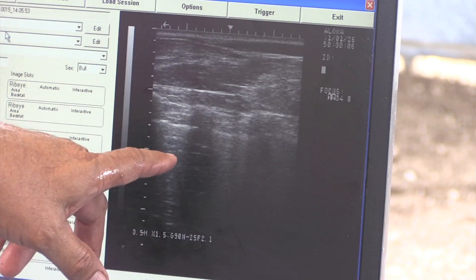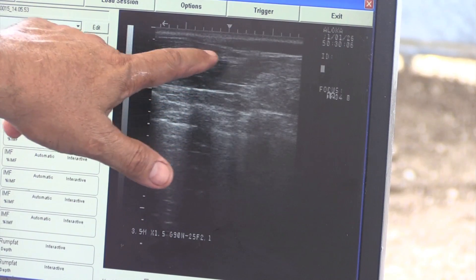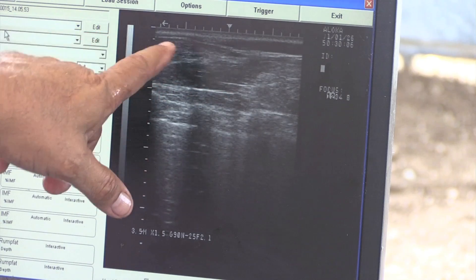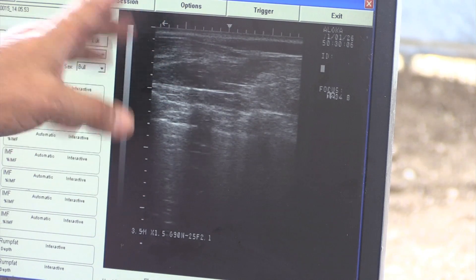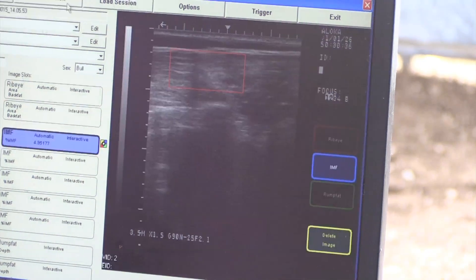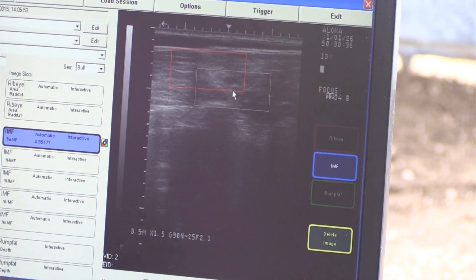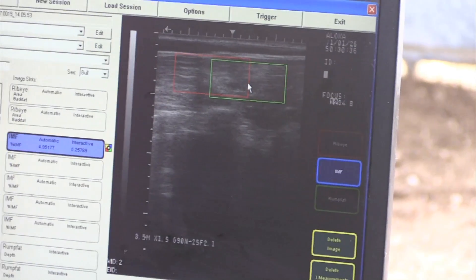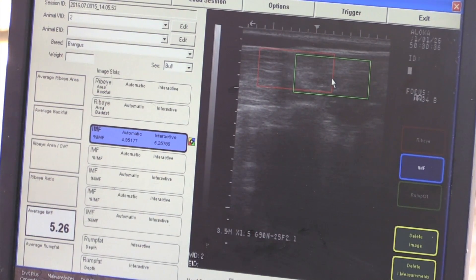This is a bad marbling image. You see the spinalis moving into the picture here. You can get an image with a little bit of spinalis, but if it's more than a third of the image, that image would automatically be rejected. This is the same cow we measured a minute ago — this image is blurred, and she just jumped a full percentage reading in her IMF just off a blurred image. That's a wrong number, and that's why positioning of the cattle and quality image is so important.